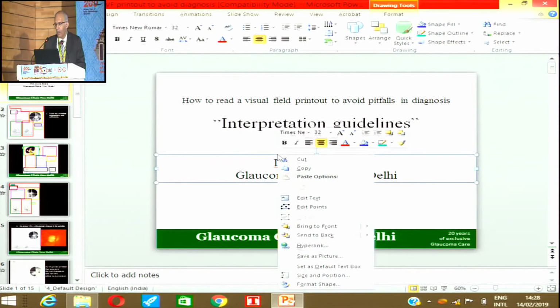So we have looked at the three aspects: intraocular pressure, we have looked at optic disc, and we have looked at visual fields. These are the classical triad that you use for diagnosing glaucoma. But glaucomas in Indian eyes are different from glaucomas that you see in Caucasian eyes. Angle closure is much more predominant in our patients as compared to what we see in Caucasian eyes. So again, gonioscopy becomes an integral part of the diagnosis or the workup that we are doing for our glaucoma.